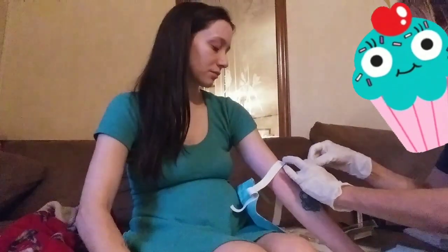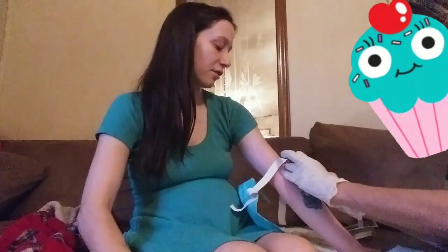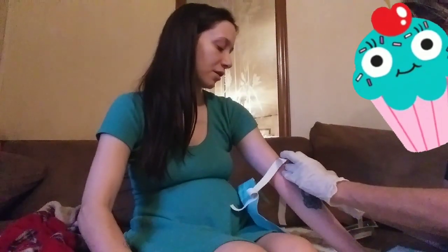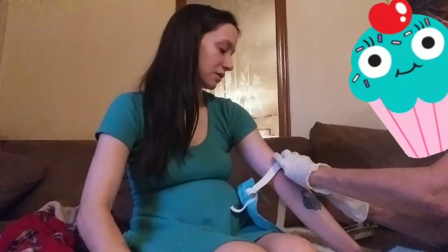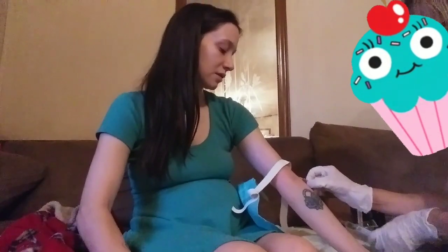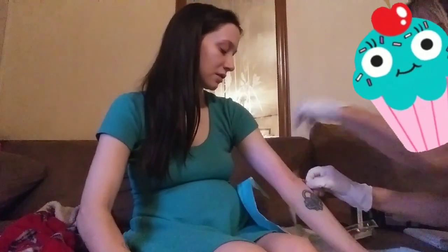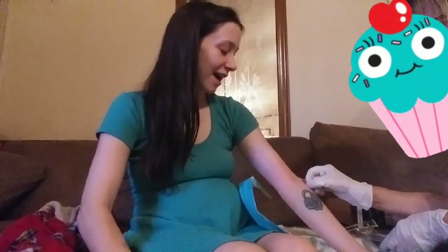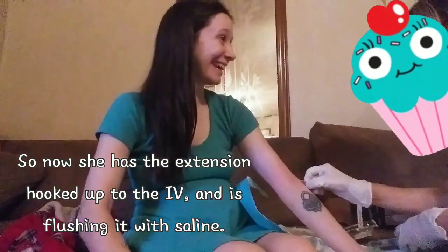That felt like it actually went in. It didn't hurt like it sometimes does — sometimes they hurt really, really bad and you can just tell that they don't go in. But that went in... I don't know, it didn't hurt as bad. God, did we get it on first hit today? Yeah! Yay! That hasn't happened in a minute.